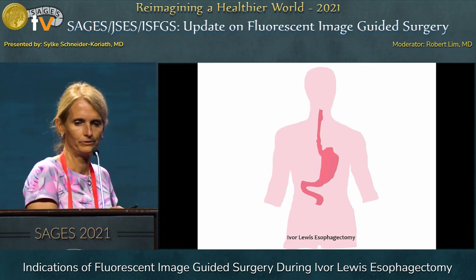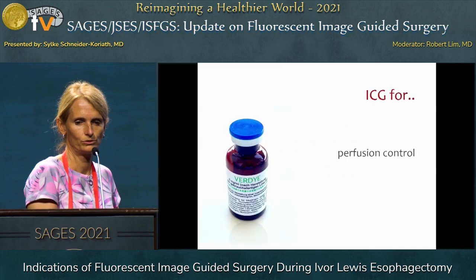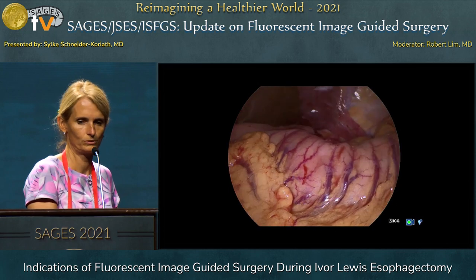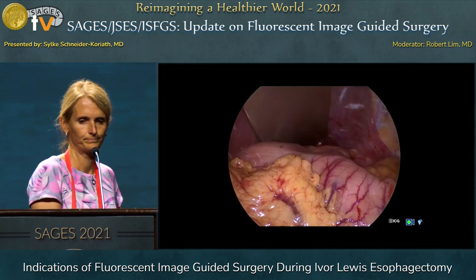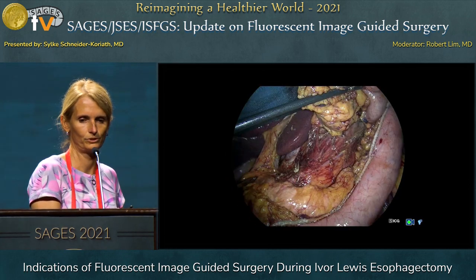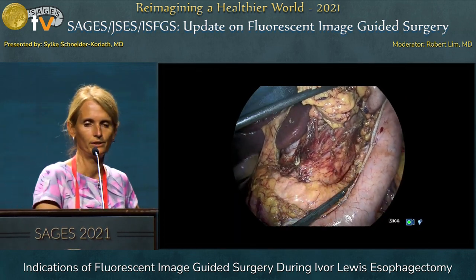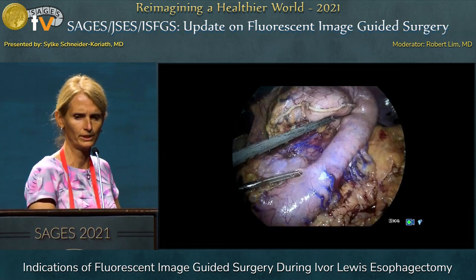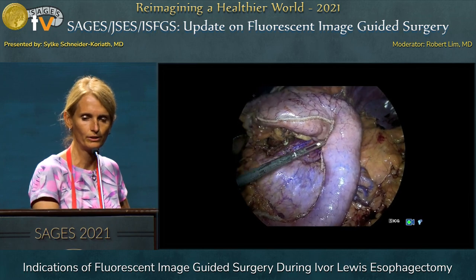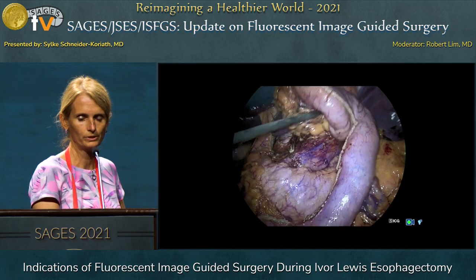It's everything already said by Raoul. Unfortunately the video is not working — it's in a laparoscopic setting. The gastric tube is already performed and we give the ICG. You can see the ICG in the greater curvature vessels and also in the tissue of the gastric wall.